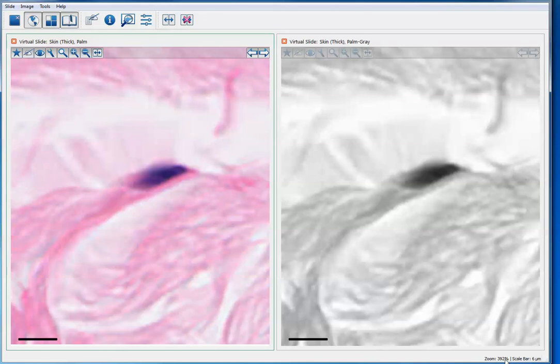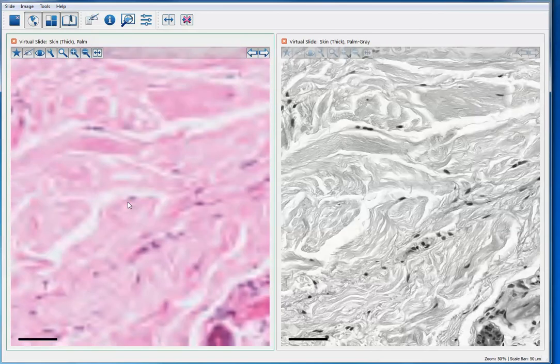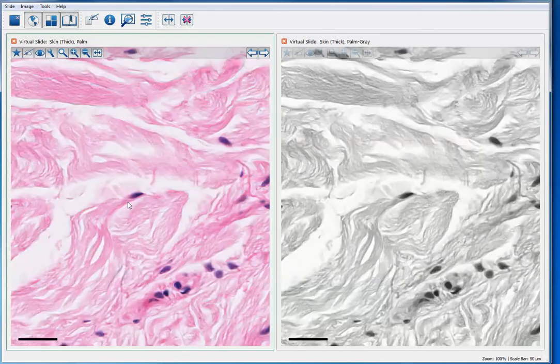Now we're down here at 392%, which the scale bar is only equal to 6 microns. You can do this on any exam or quiz. If you go too far, it's going to be really blurry. And we can now return back to the 100% or 50%. So hopefully this will get you thinking about not just memorizing a particular field in WebMic in order to identify something in a virtual slide specimen, but we'll be thinking about shape and size and relationship in future attempts to answer questions.